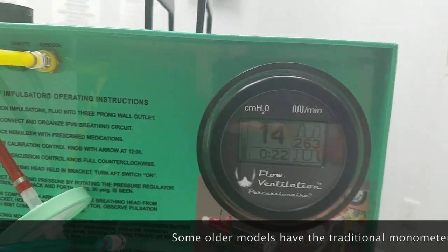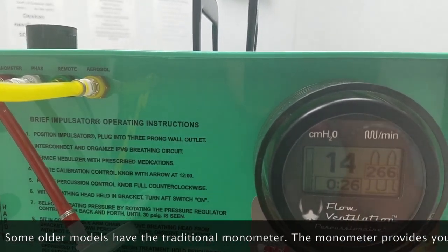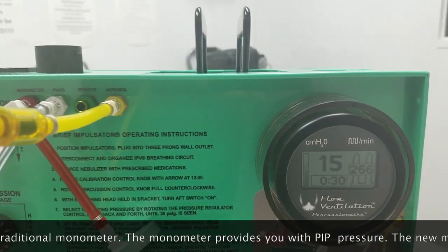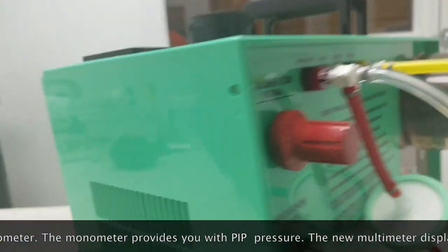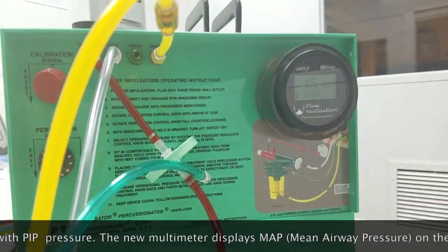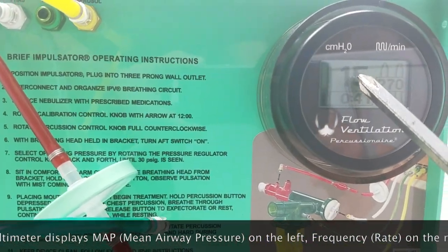you're going to notice a new feature on this device called the multimeter. This multimeter is replacing the previous manometer that we've used in the past to show pressures. We get some added benefits and usage out of it, like our MAP or mean airway pressure, the rate of the percussor, and also a timer for length of treatment.